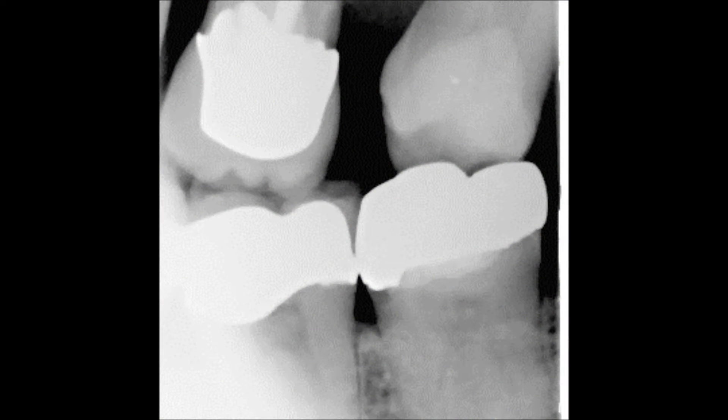As evident on the radiograph, the gold crown on tooth number 18 has decay at the mesial interproximal margin. The crown will be replaced.